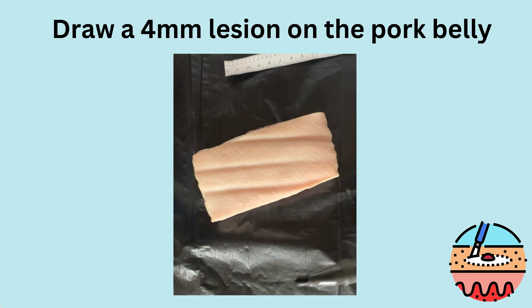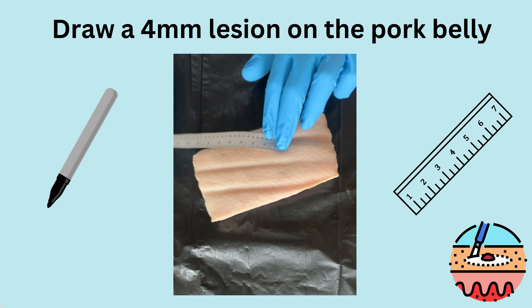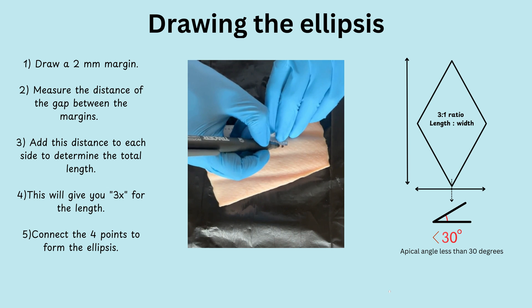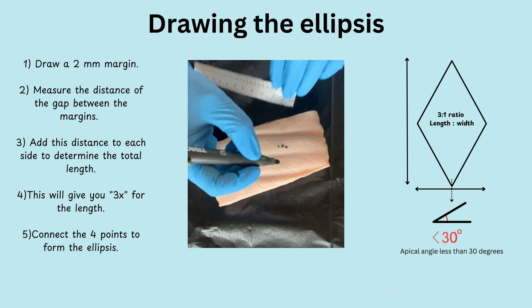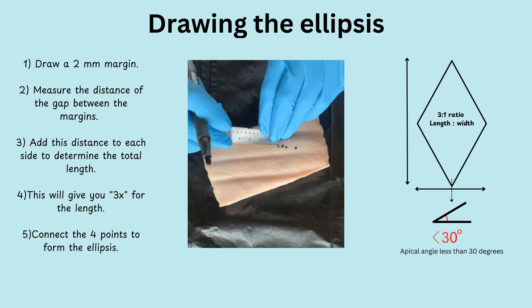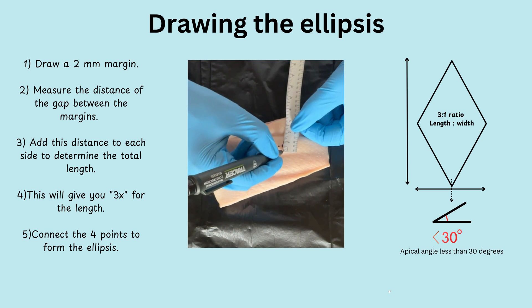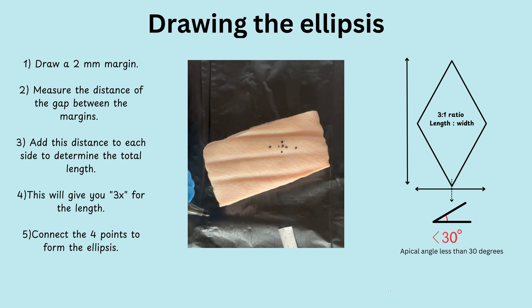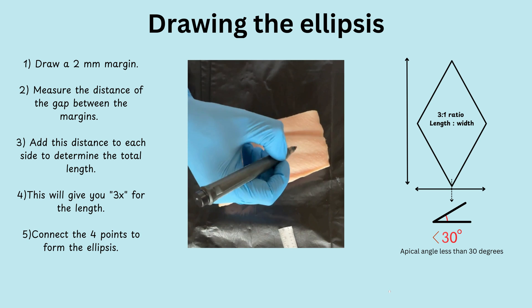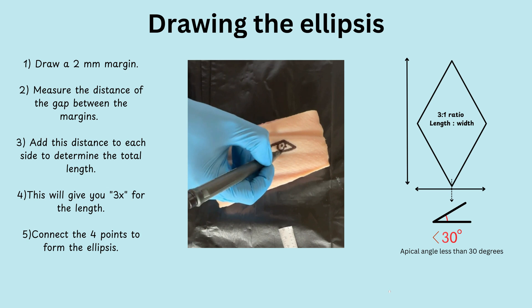To start the workshop, use a marker pen to put a four millimeter dot — this is our pretend lesion for excision. For today's workshop we're using two millimeter margins, though this can vary in clinical practice. Using the marker pen, create a design with a ratio of three to one for length to width. The apical angles at the top and bottom should ideally be less than 30 degrees to help ensure primary closure. Follow the direction of the skin folds to reduce tension.